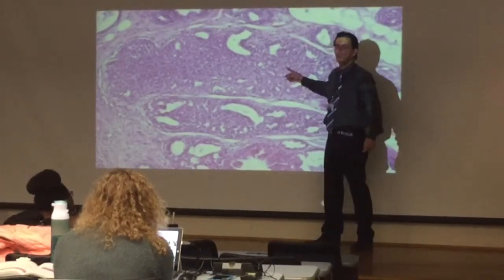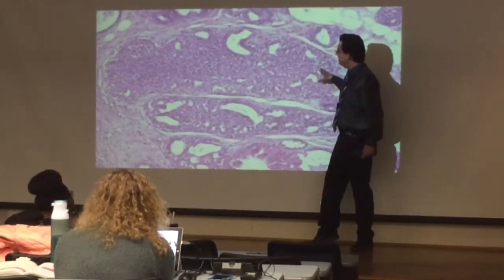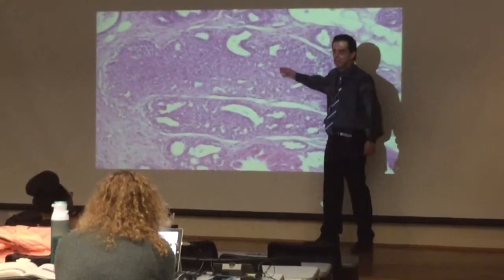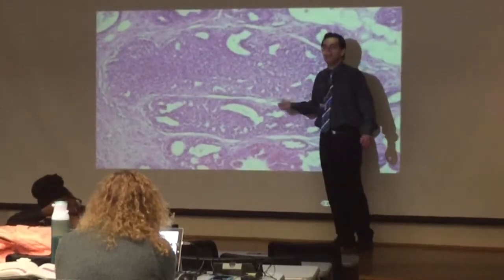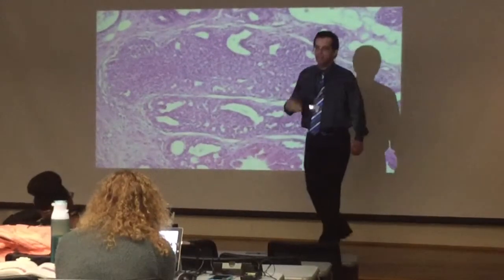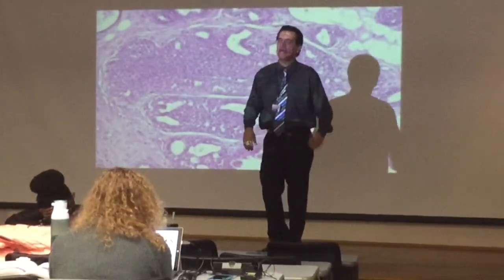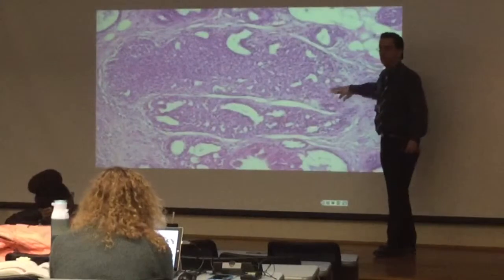This increases risk of future cancer about 1.5 to 2 times. You can see this is actually composed of two types of cells: ductal luminal cells and myoepithelial cells. Next step after this is atypical ductal hyperplasia. Next step after that is ductal carcinoma in situ. After that, invasive cancer. So at this level, increased risk is 1.5 to 2.